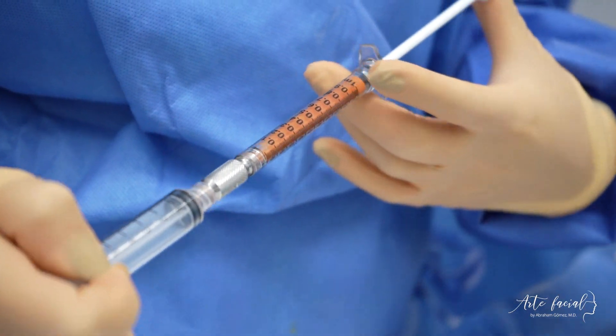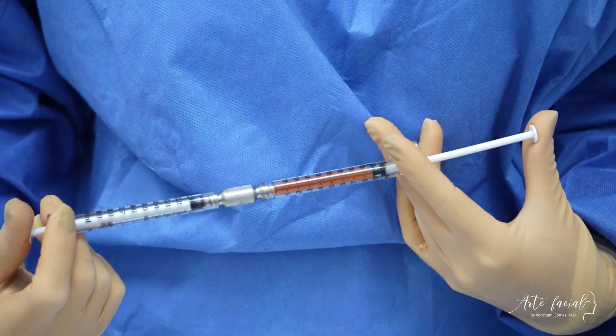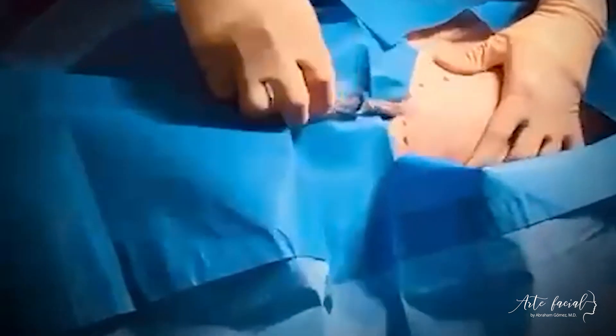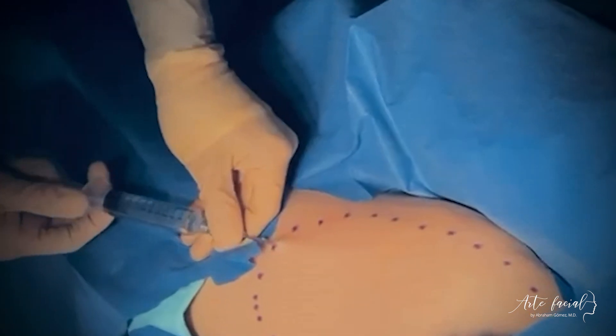Facial fat transfer can be performed for reconstructive or cosmetic purposes. Regardless of the indication, the procedure should be done in a sterile environment. The first step consists of infiltrating the areas from which fat is to be harvested with a dilute anesthetic solution. It is important to use the right volume and concentration of this anesthesia to avoid over-diluting the fat.